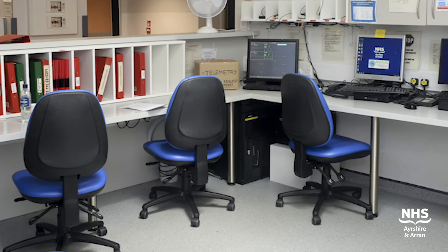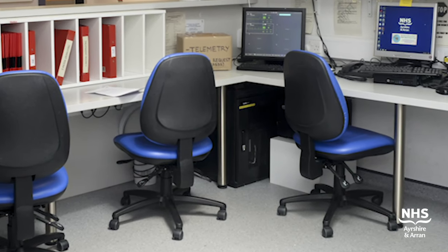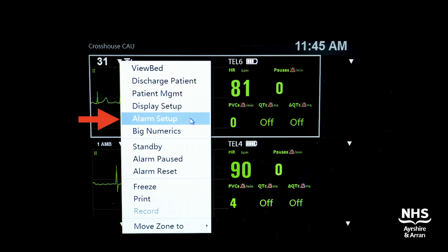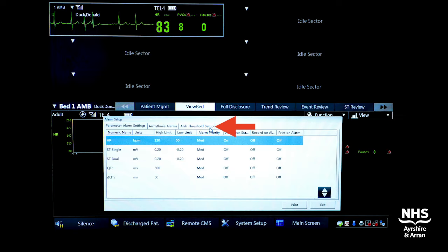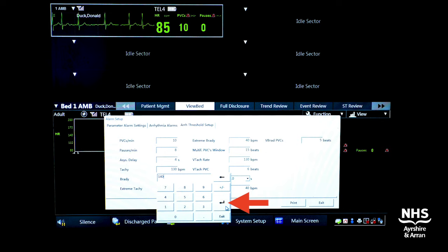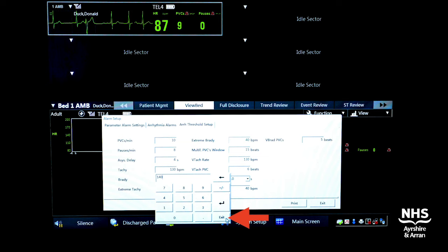This will be printed from the printer underneath the desk in the initial assessment area. To adjust alarm parameters, again click on the triangle at the top left of the patient in question's telemetry screen. Then click on alarm set up. Next, click on the arrhythmia threshold set up. Enter the new value in question, for example a new bradycardia alarm cut off. Click the return button and then press exit or OK.